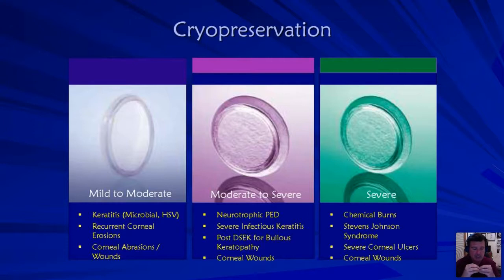And the analogy I like to use is bubble gum. You put a piece of bubble gum in your mouth, you start chewing on it, and it's got that great spearmint flavor. And after about 5 hours, it's kind of gone. You can tell that there's a little bit of flavor there. So 5 days is what you really want that amniotic membrane on there to really download all those cells and create as much regenerative healing.